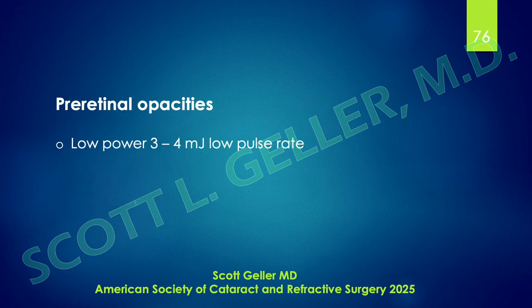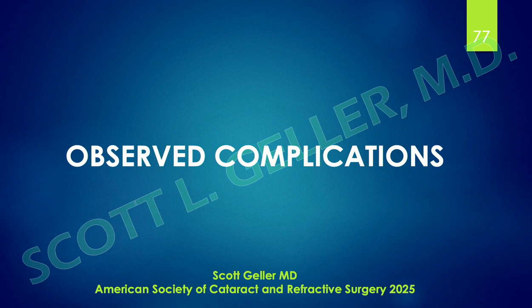Pre-retinal opacities, these are the definitely most challenging. And it can occur with a PVD, very often does. You've got to use low power and a low pulse rate, but there are ways of getting these type of opacities. We'll go over that in a few minutes.